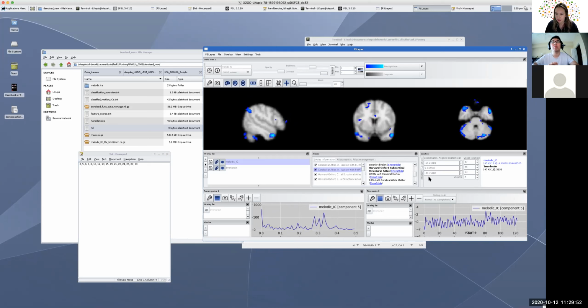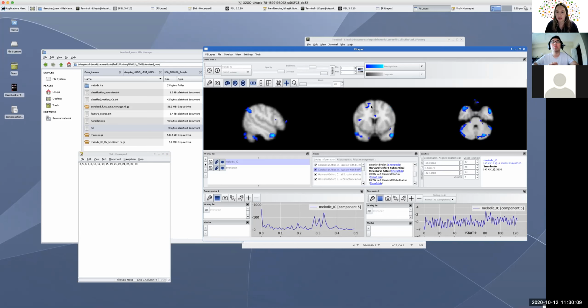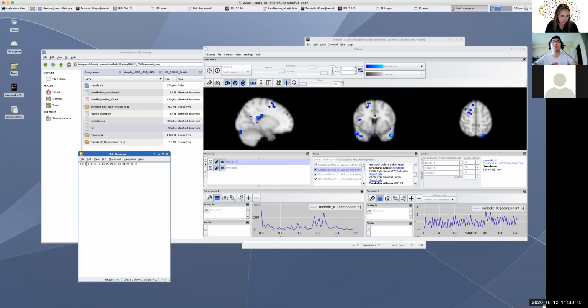And then some white matter, it's kind of ringing. Yeah, there's not much going on in here, but it's kind of just wrapping around the brain. So that also kind of tells you that's going to be noise. So this one is number 5, and they already have it on there, so I don't have to write it down.